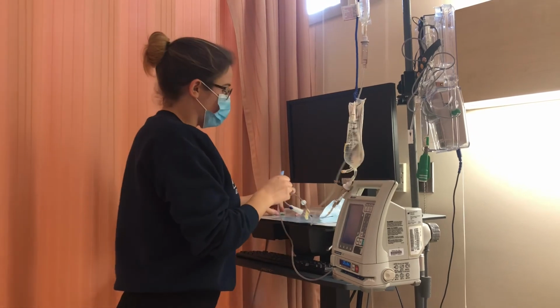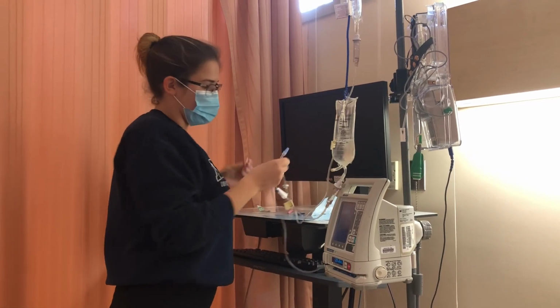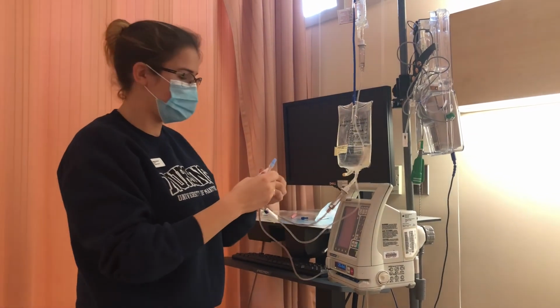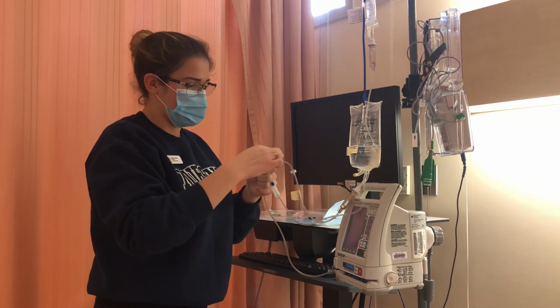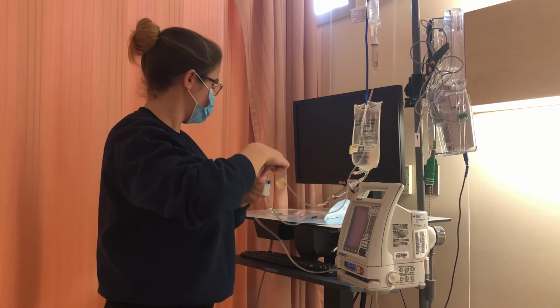So I'm going to grab a new alcohol swab, and I'm going to clean the port for 30 seconds. So 30 seconds has passed. I'm making sure not to put it down. So I'm going to attach it. Okay, great.